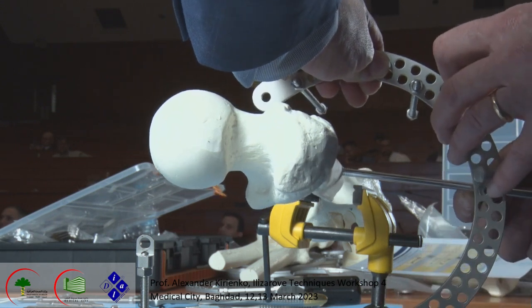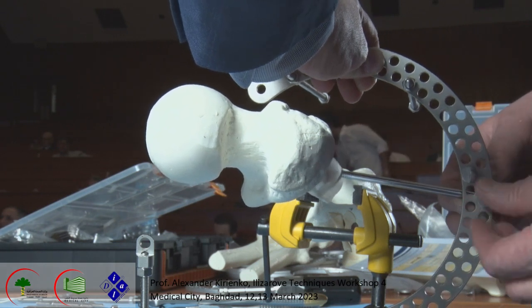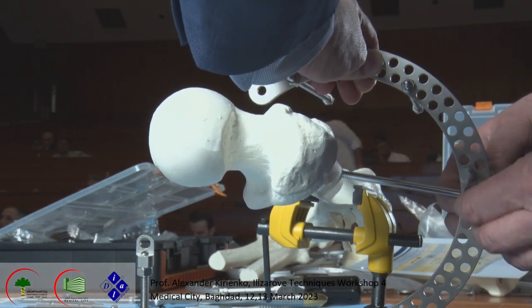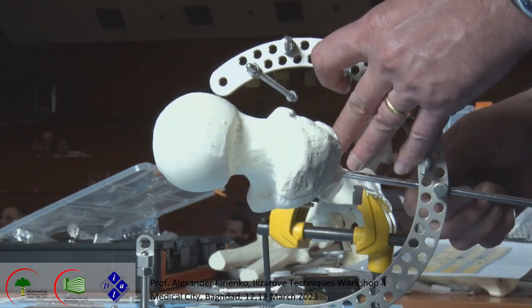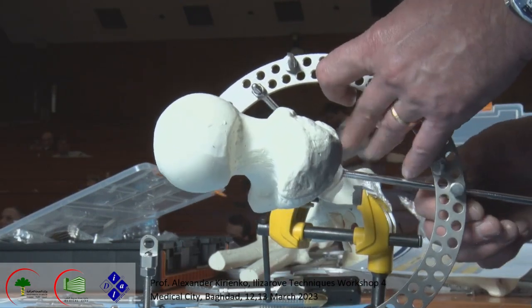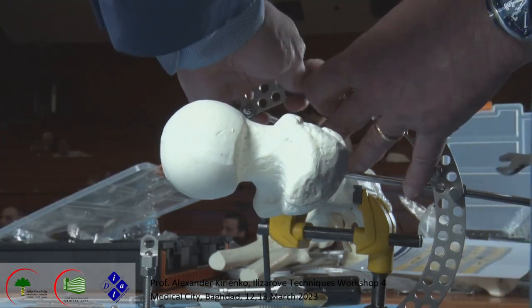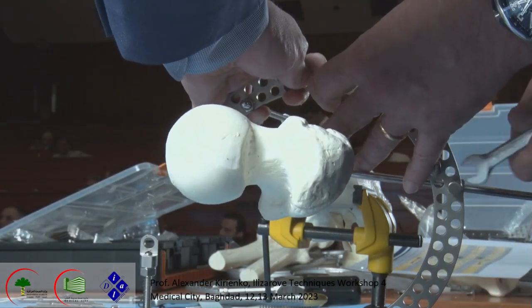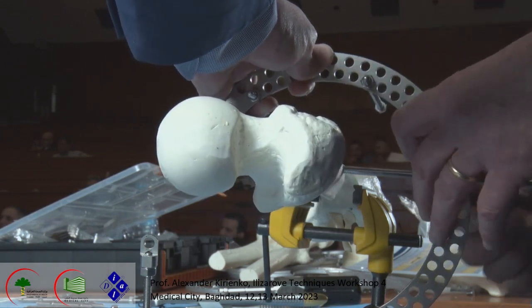This is quite lateral on this. Okay. We put this half pin oriented to the X-ray. And now we fix it. Obviously, the anterior part is a little bit near the skin, and posteriorly there is a big volume of muscle.